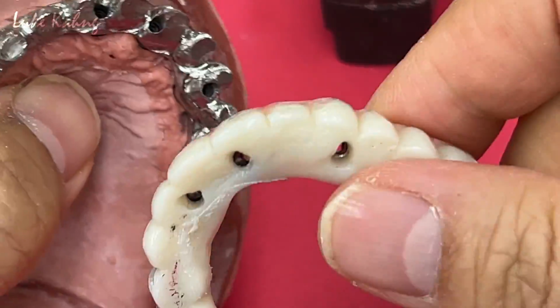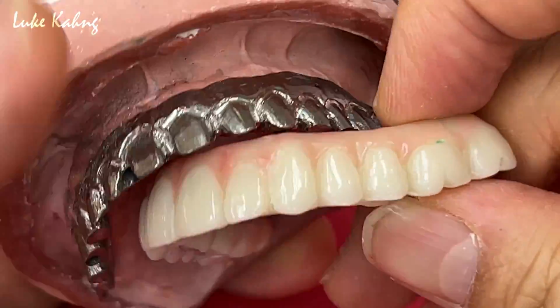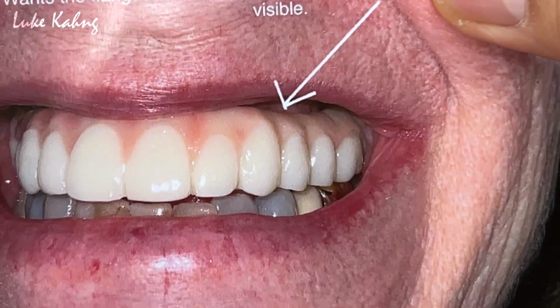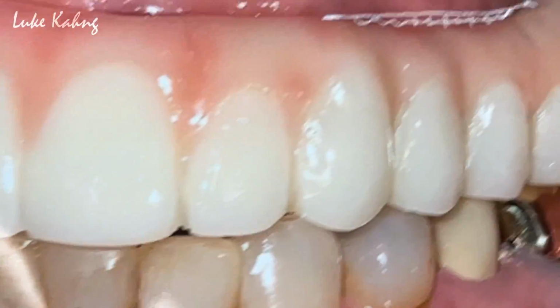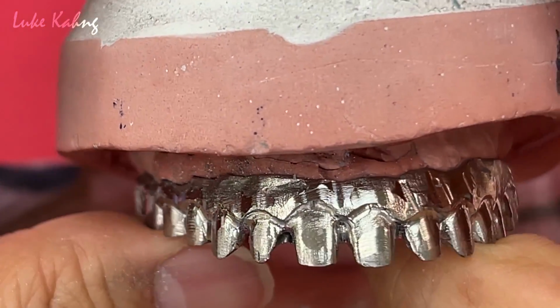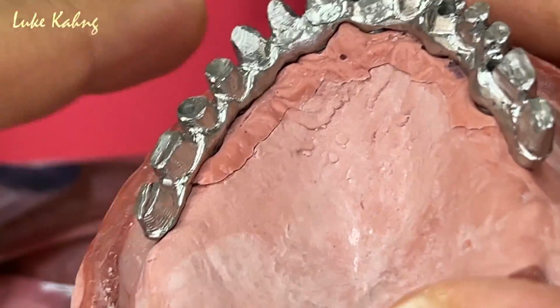Now, we made this really thin, that area is a very specific design compared to PMMA. This is a prototype, but I promised her we'd make a really good frame design, especially with the cover, which is like I indicated previously, the doctor showed us here. Okay, it's not visible. And then this, add here, over there. Other side as well. Okay, now ready to pack. Underneath we fill it with the metal after I trim it, so we're going to polish it.